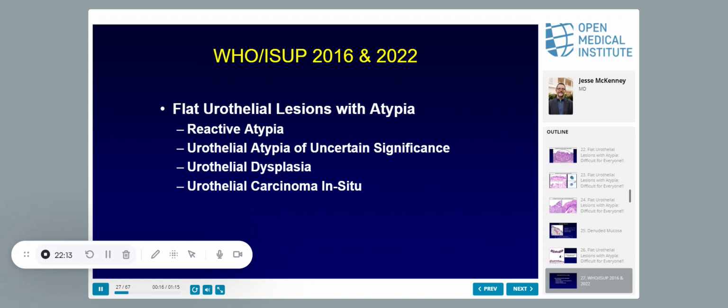Which type? Not that we know of, the glandular CIS. The reason that I list it is if somebody else gets a biopsy and they see something glandular, they need to realize that it's urothelial and not an adenocarcinoma. Because by the way we define these is just the rules.